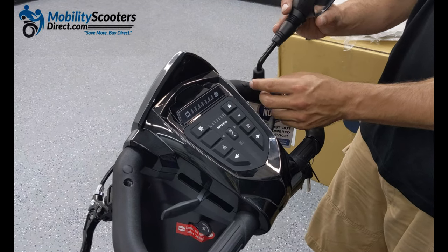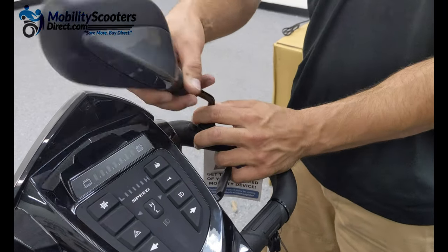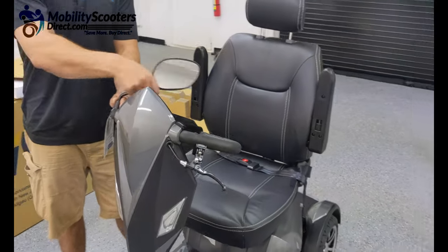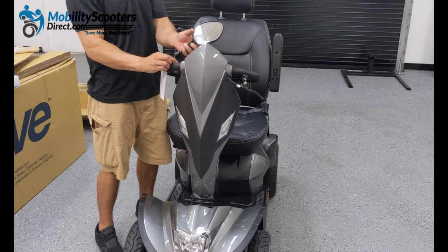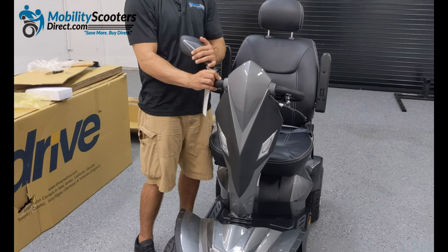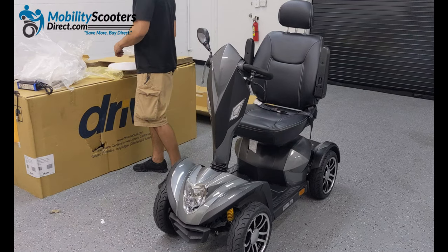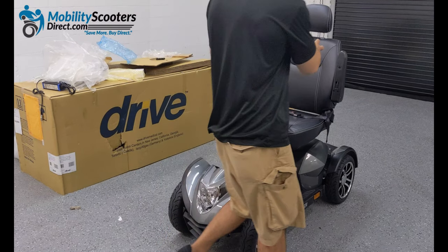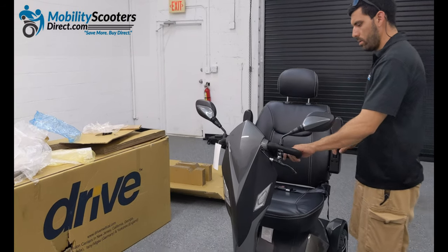The mirrors can be attached very easily. There's threading at the end and it simply twists right in like a bolt rotating into place. Simply rotate the mirror clockwise until it's tightened all the way. You may need to make some additional adjustments to the base, which rotates freely and acts as a tensioning nut towards the base of the mirror. We've installed the right side mirror and will now take the left hand mirror out of the box and install it the same way — simply get the threading into the hole on the tiller bar and rotate clockwise until it's locked into position.